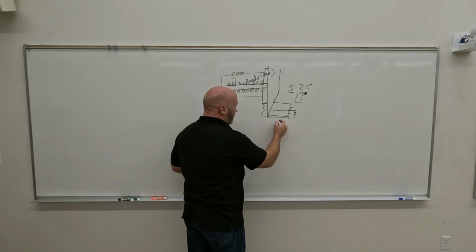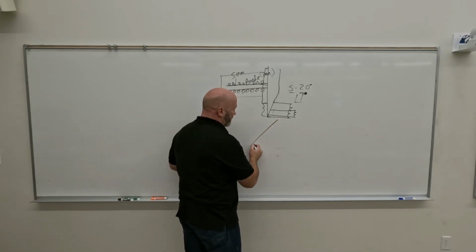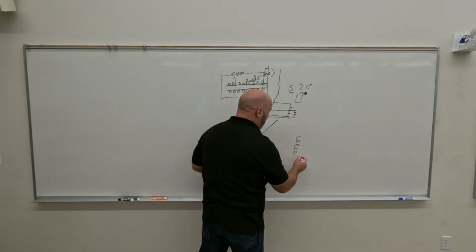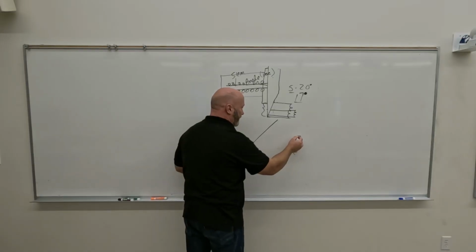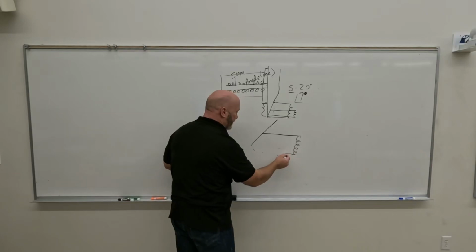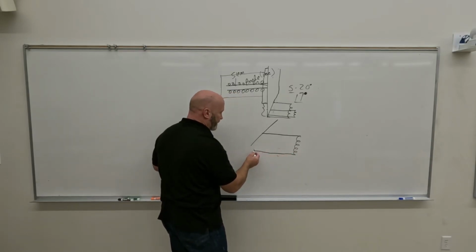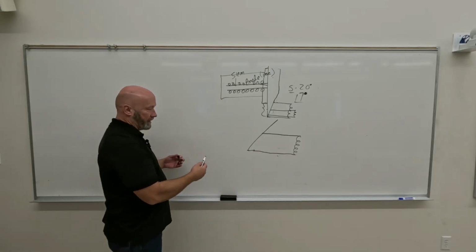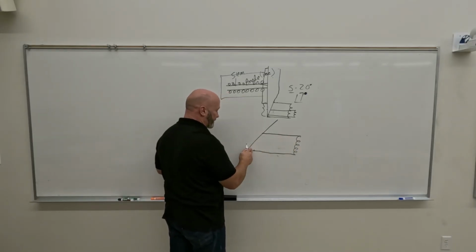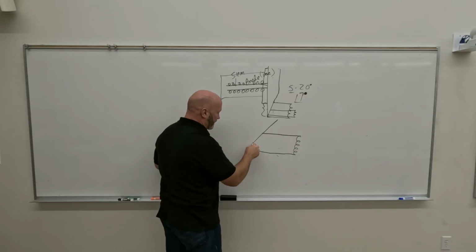Now, what we have, let's say if I could draw this on a perfect 45-degree angle, if I were to draw our electron stream coming across, impacting, and let's say our X-ray beam was reflective of our stream of electrons. I kind of tapered that off a little bit.